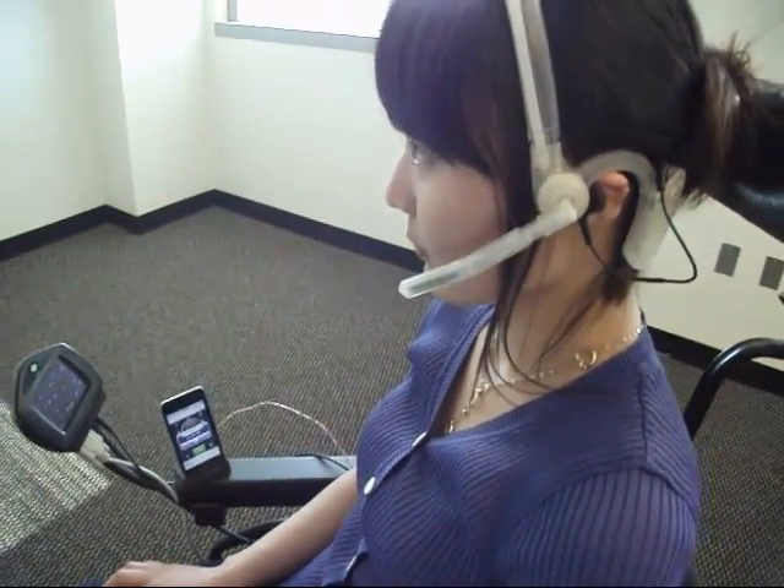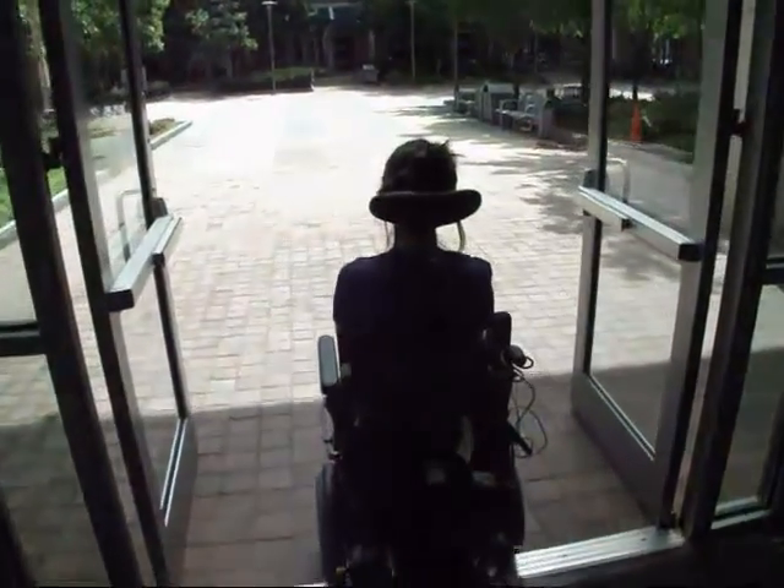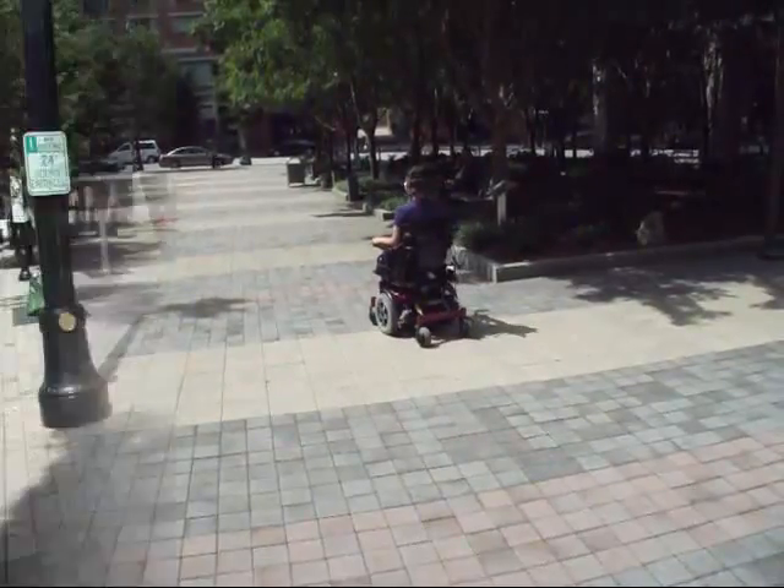She can also use her tongue to dial numbers and make a phone call to a friend. Now she is driving a powered wheelchair, and she can easily go outside of the building using the tongue drive system.